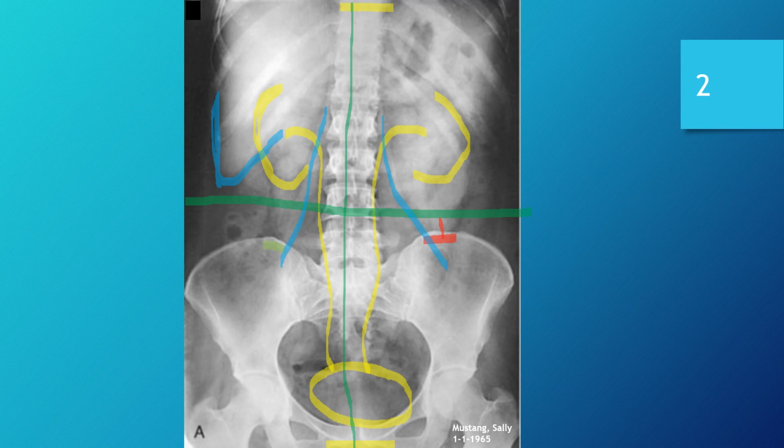It, as you can see, causes a little mottling obscurity right there on the right side in that pelvic wing, and then on the presumed left side as well, there's a little bit.